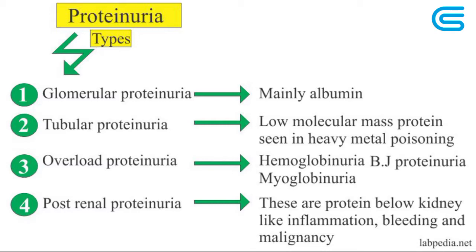So we also have some other types of proteinuria, such as overflow proteinuria, that is from the plasma directly into the urine, such as immunoglobulin light chains or Bence Jones proteins. I'll speak of Bence Jones proteins a little bit later on. Plasma cell dyscrasias, hemoglobin, all these things, when there is an overflow, might lead to proteinuria.